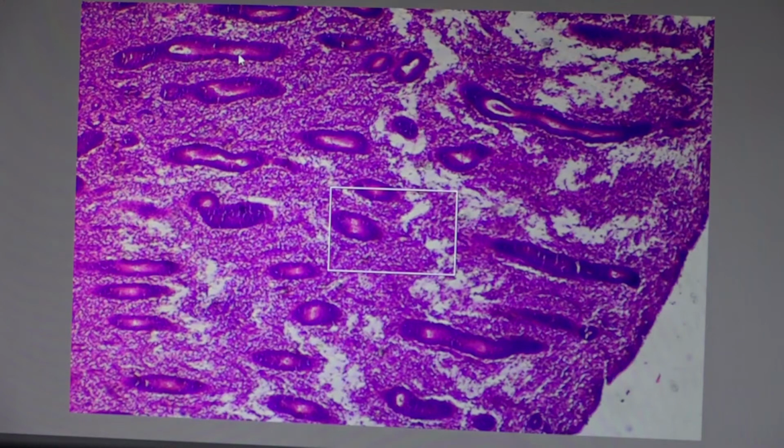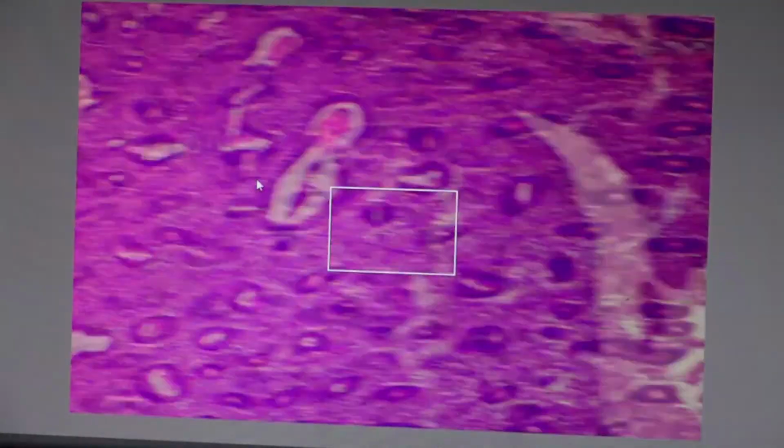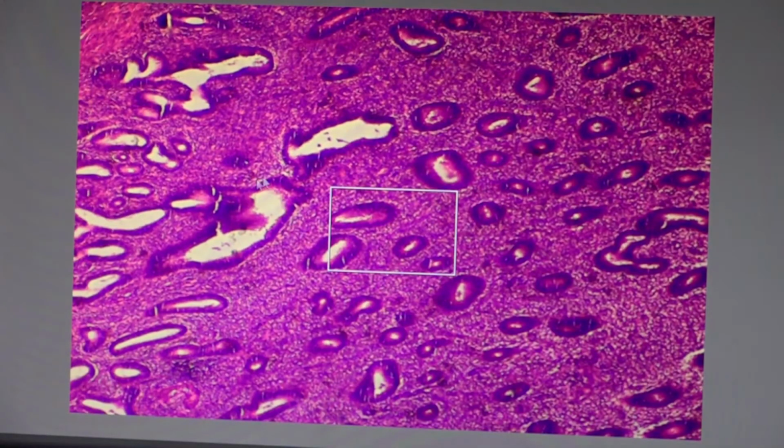The glandular epithelium forms many glands with a back-to-back appearance, and sometimes cystic change. Back-to-back appearance, cystic change of the glands, proliferating glands, benign-looking, no atypia, no complexity of the glands, no frequent mitotic activity, no pleomorphism. This is called endometrial hyperplasia.